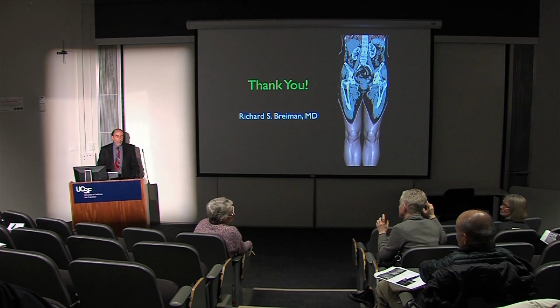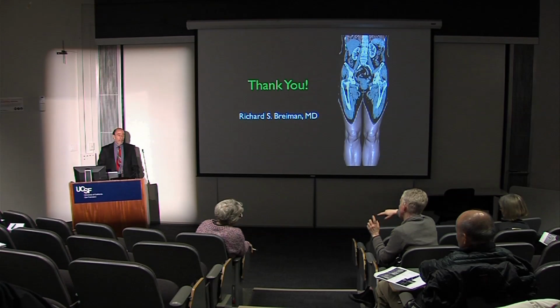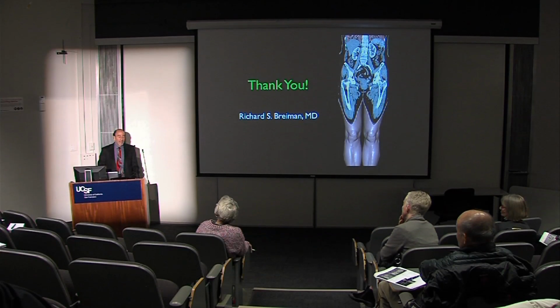When someone goes to Stanford or John Muir or Sutter and they get a CT done and they take it to UCSF, are we now at the point where everybody can read everybody's information, no matter where it was generated? I don't know about everywhere, because I think many parts of the world are still using film, and they're still hanging their film to dry. Or maybe they have a machine to go through the chemicals. But here in the Bay Area?